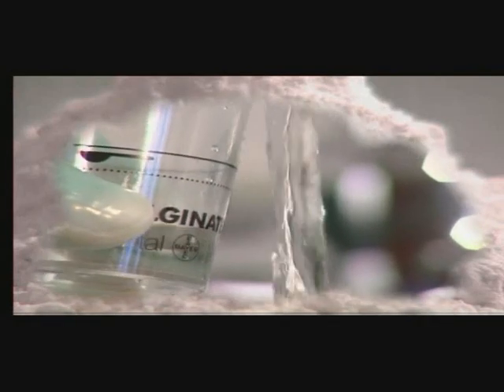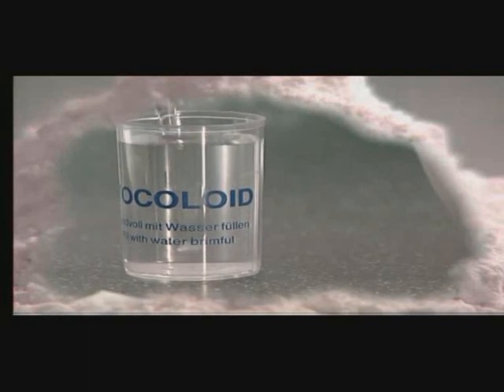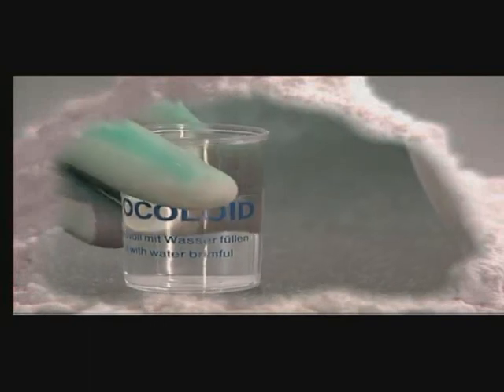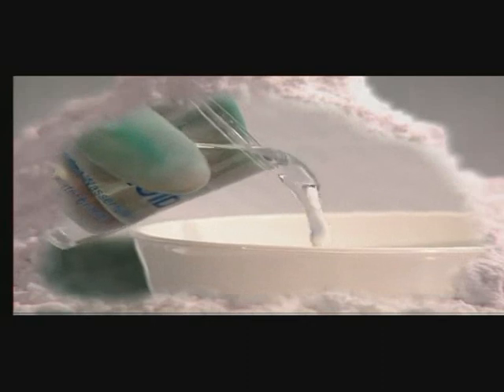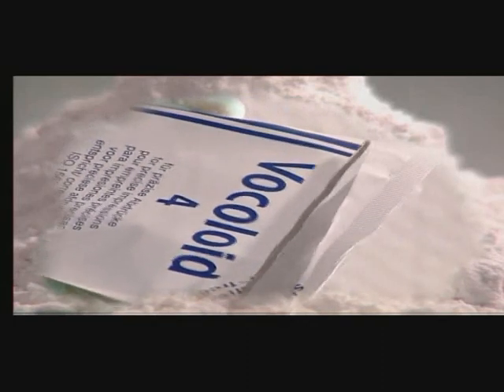For taking optimal impressions, the amount of water must also be measured precisely. The mixing water's temperature influences the setting time. Colder water lengthens the processing and setting time, while warmer water shortens it. To prevent agglutination, the measured water amount is firstly added to the mixing cup as close to room temperature as possible. Dosing bags are simply cut open and all their contents poured into the water.